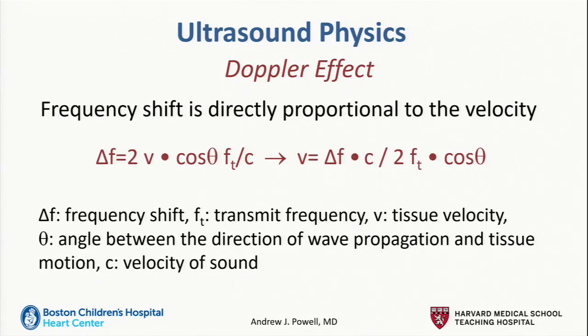So we're going to use that in ultrasound to help us measure velocity. Specifically, we're going to know that the frequency shift is directly proportional to the velocity. Now, you don't need to memorize this equation, but I'm putting it up here just to make a couple of quick points. So here it's saying how to calculate the change in frequency, and I've just rearranged this equation to this one here to solve for velocity.